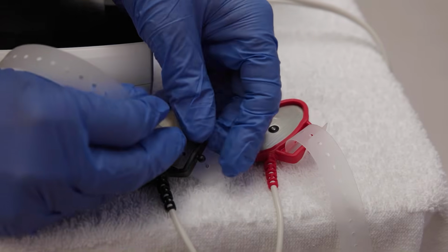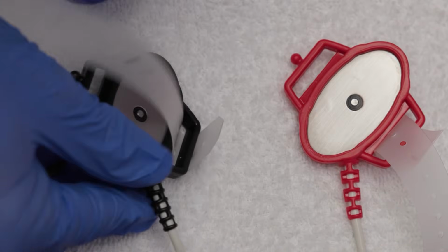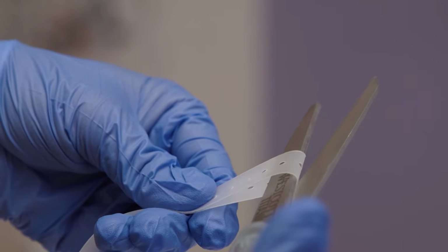Next, pre-attach a strap to each electrode. A tip for infants and toddlers, you can cut straps in half for a better fit. You can also pre-attach a strap to one side of each of the collectors.